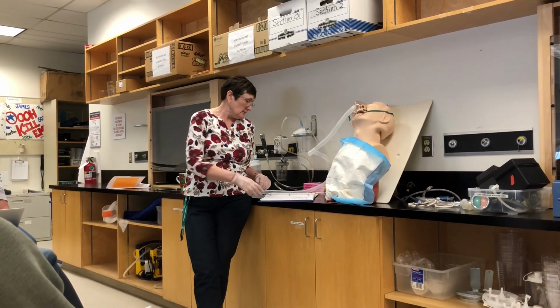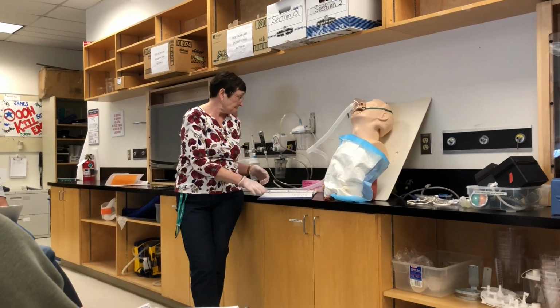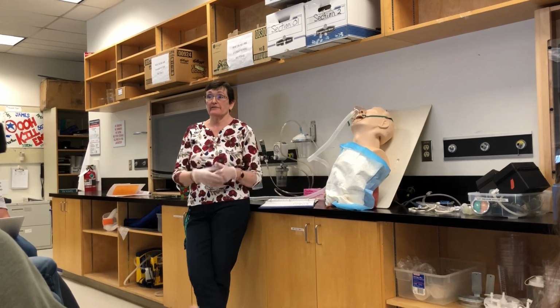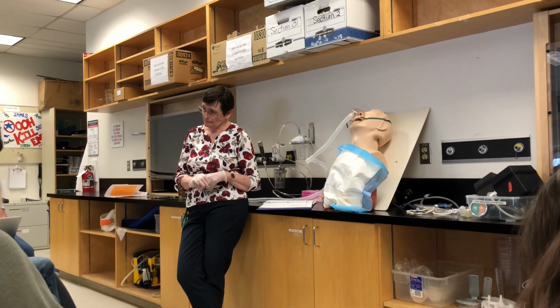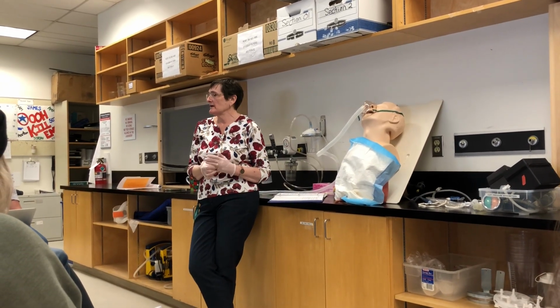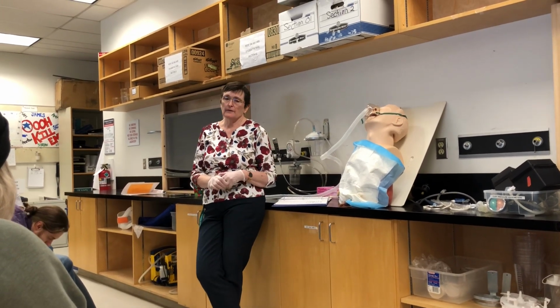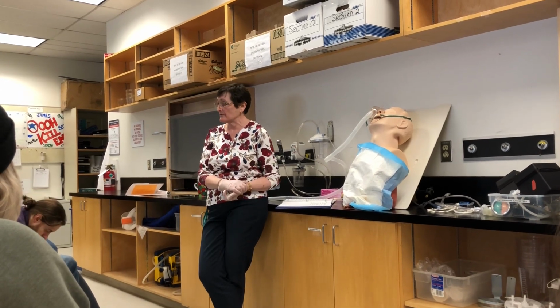So we'll leave them sitting up, because it's much easier to breathe sitting up, and then clean up whatever we have to clean up, and then keep monitoring about every 15 minutes. Would the physician order for the extubation have nebulized epi if needed in it, or would you have to get it? No, we kind of use that as our own call, do we need to give it or not? We have the right to give whatever medication, we'll just get an order for it afterwards. Okay. Yeah.